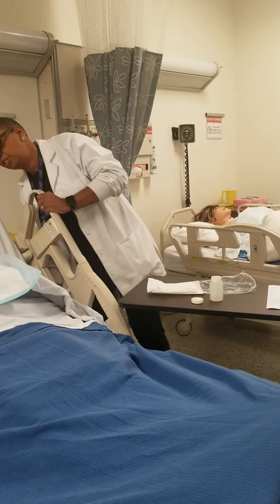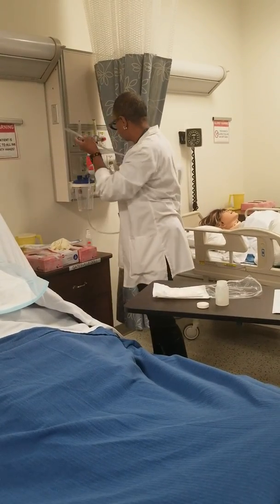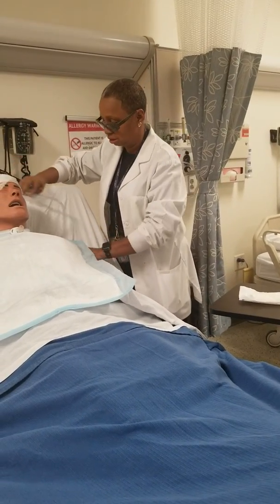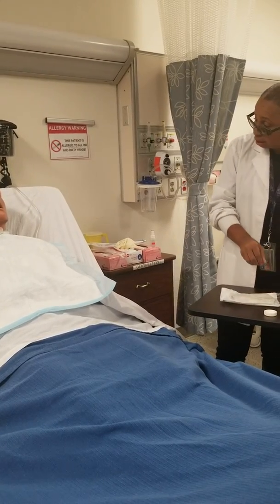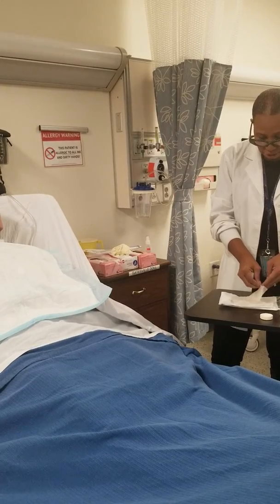So I'm gonna get in position. I'm gonna bring this closer to me. I'm gonna have the suction on. I'm gonna bring this right to him. Okay, so it's close, because I can't be messing around once I get these gloves on. It came out. Oh, that's okay. We weren't gonna suction anyway. So put your gloves on.